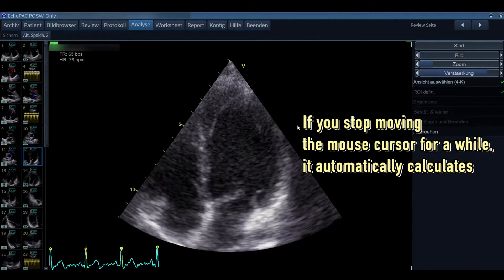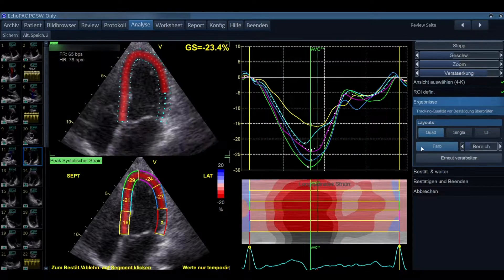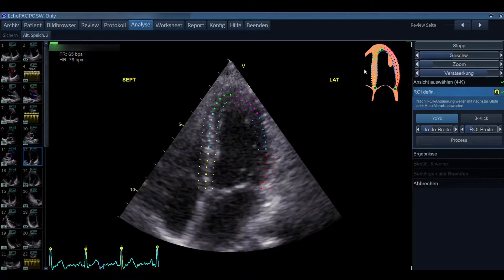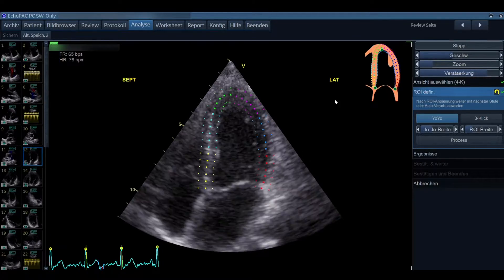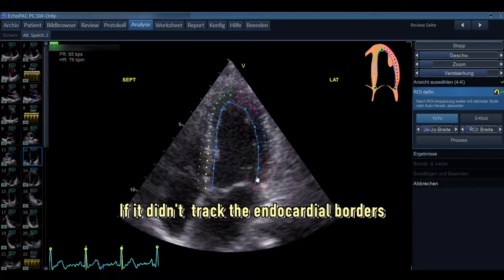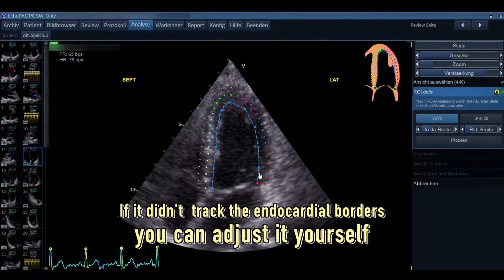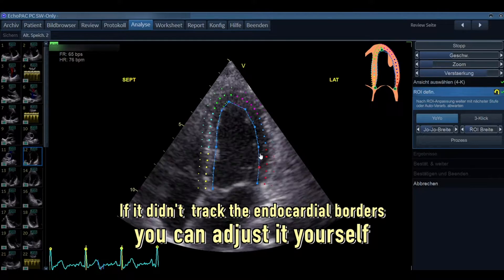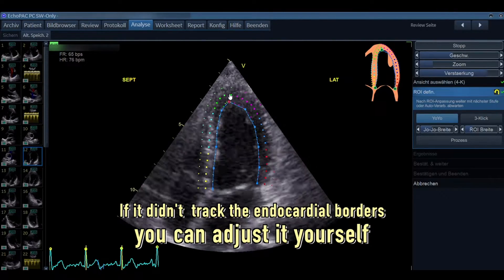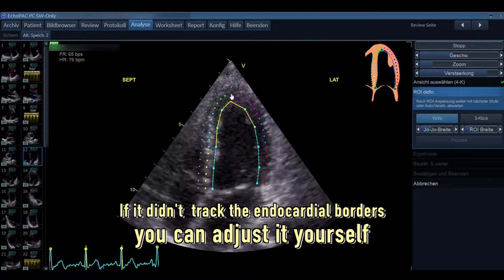If you stop moving the mouse, the program will auto-calculate, but we don't want that — we want to optimize our image first. If the machine didn't track the endocardial borders perfectly, we can adjust: just press with the mouse on the inner side and move the dots to where you think the endocardial borders are located.